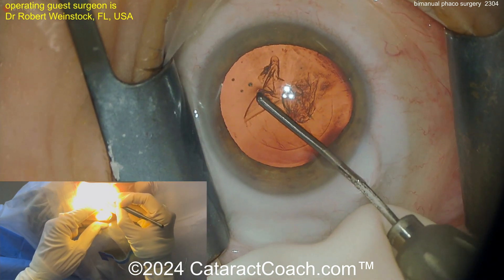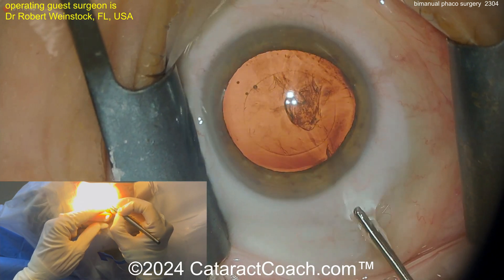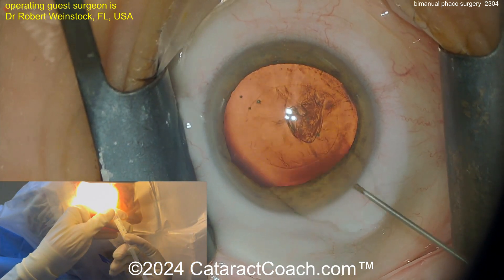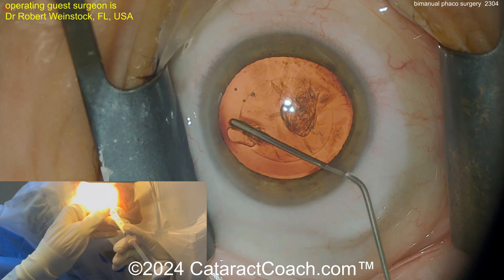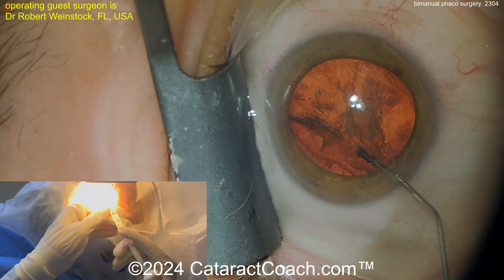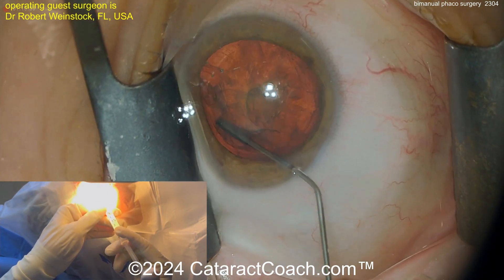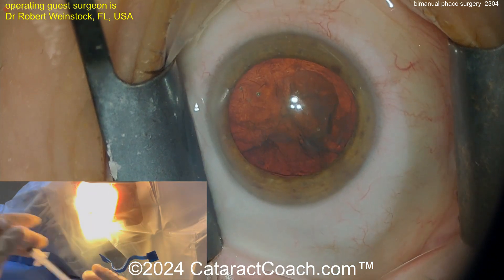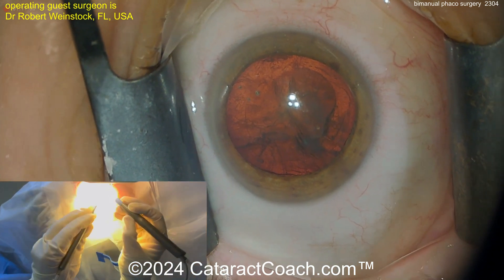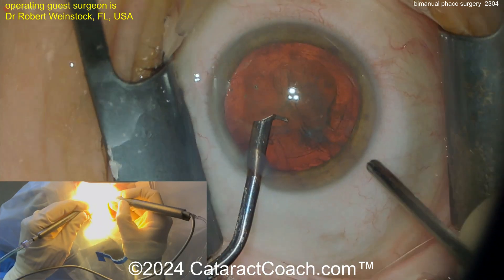There are some advantages of separating the infusion from the aspiration. This technique was very popular and gained a lot of traction in 2007, 2008, and 2009 — for you youngsters who weren't around doing cataract surgery at that time. I tried it myself and did hundreds of cases with bimanual phaco, but I didn't find it had much traction because I still had to enlarge the incision to put the IOL in.